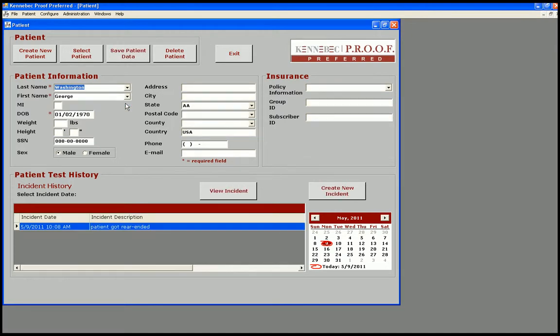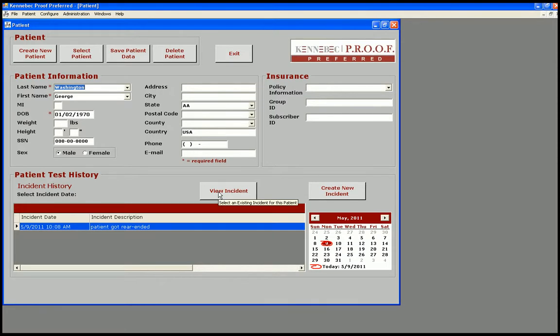The minimum information needed is the last name, first name, and date of birth. We organize the patient data by incident. An incident is defined by the purpose of the patient's visit. A patient can have multiple incidents throughout his relationship with you.